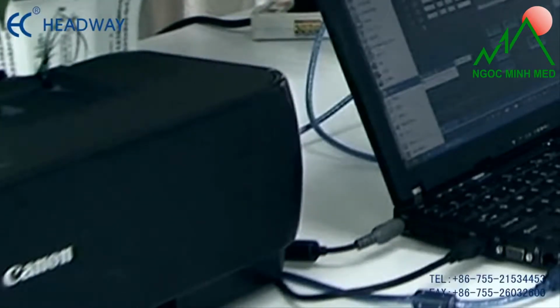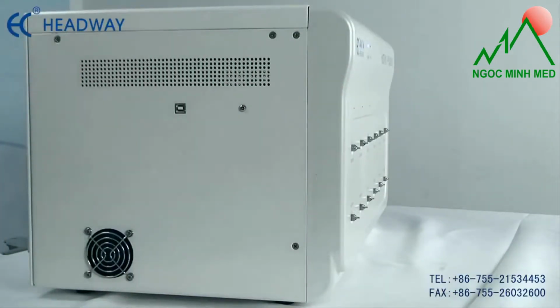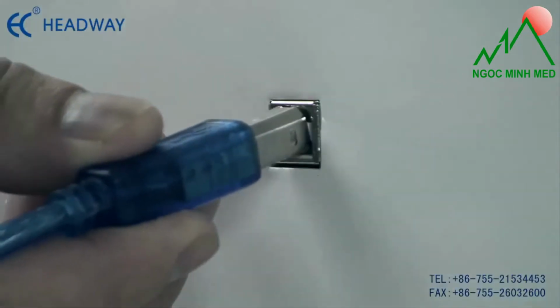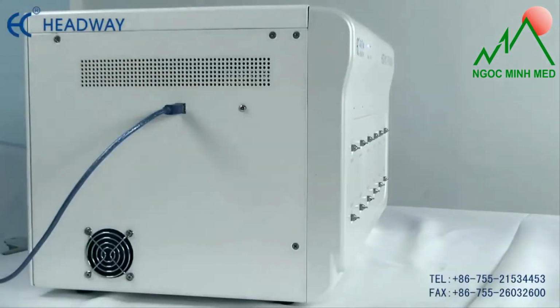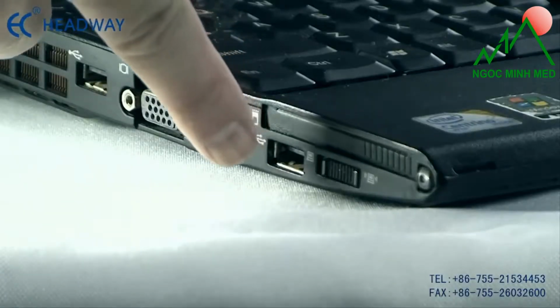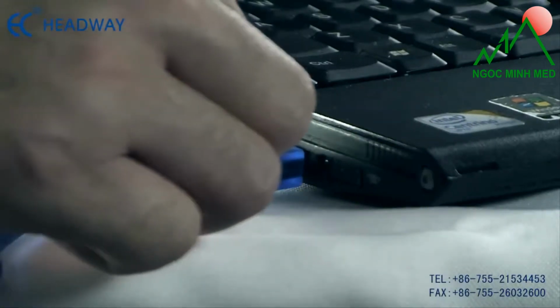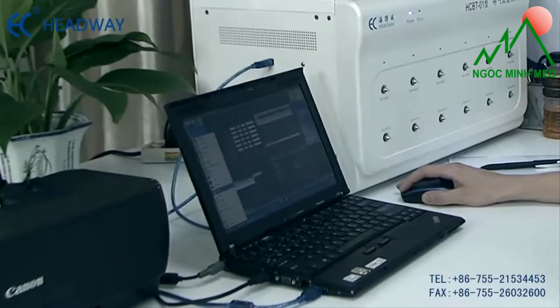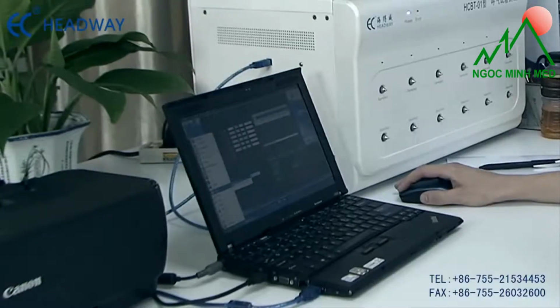Configuration of the user's computer and printer. Please refer to the user menu. Connect the device and computer with the USB data cable. Connect the computer with the printer. Please follow the instructions of the printer to connect and install the driver software.